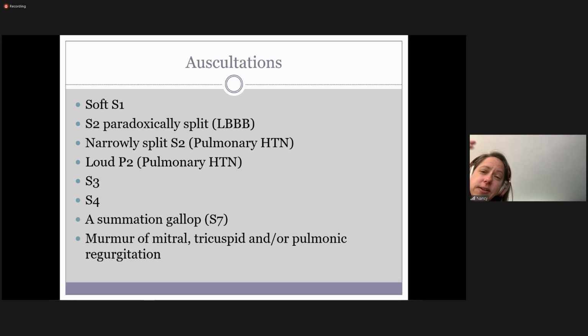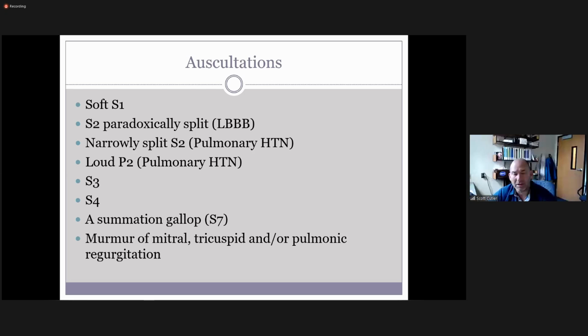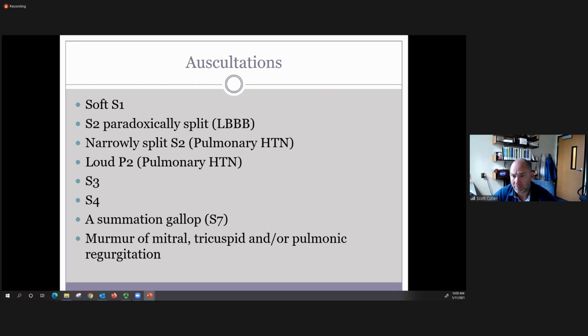Right, but I understand that time is also very limited. They're like, push patients in so you can do 8 to 10 echoes a day. You don't have time to auscultate. Well, it depends. Once you get good at scanning, you will have time. One of my students down in Boise was commenting the other day that he's down to 30 minutes of scanning.